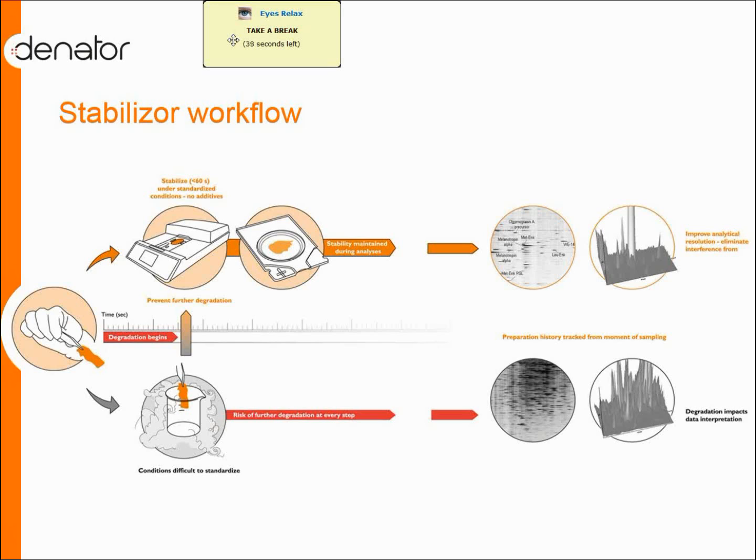This is also good for biobank samples, or samples collected for multiple purposes, where you don't know ahead of time that they will be utilized to assess certain molecules which are preserved by stabilization. It could also be advantageous to stabilize them in the frozen form.